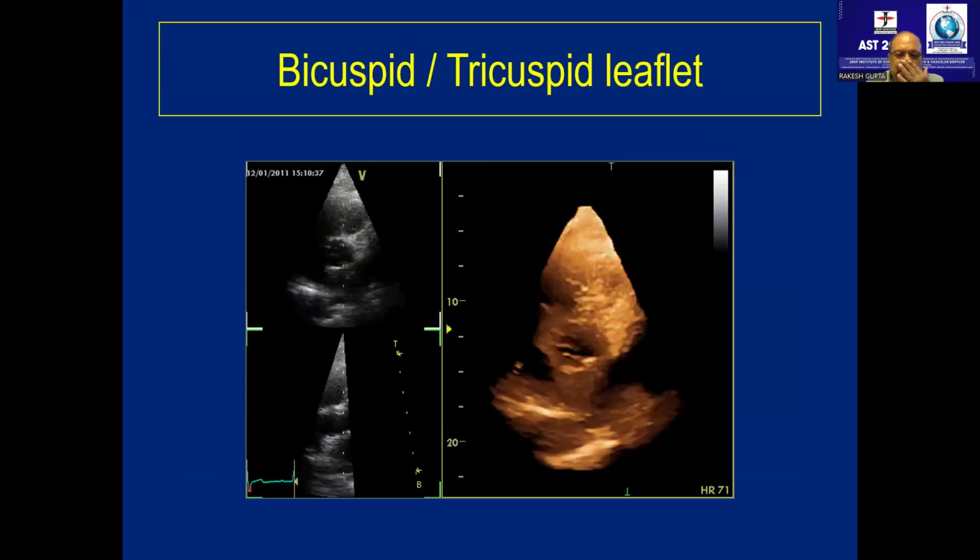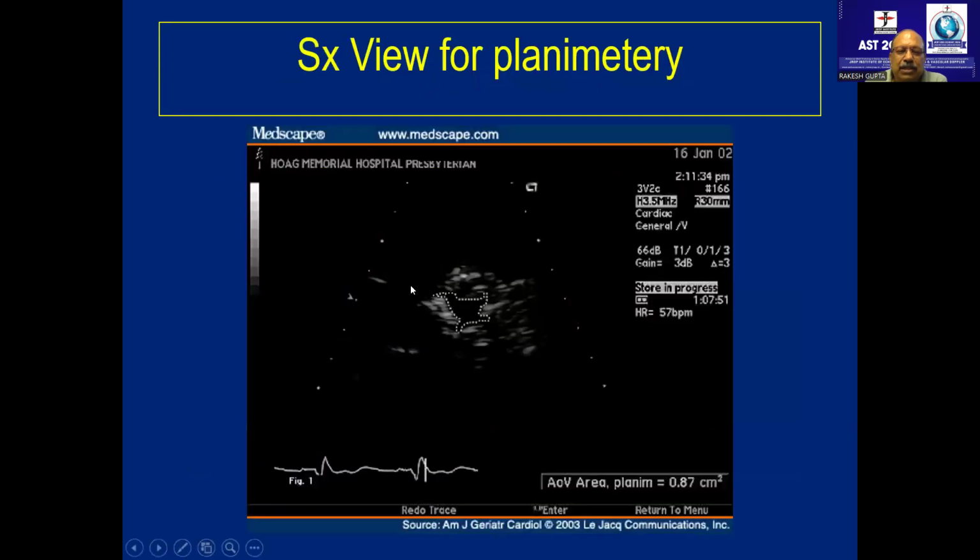Okay, I'll just show you this picture. This is the transthoracic aortic valve area which I'm trying to calculate over here. How fuzzy the lines are. And this area does not match with the aortic valve area when we do surgery. If I do a transesophageal echocardiography, my calculation of aortic valve area is extremely perfect. Let me now go to transesophageal. Give me a second.